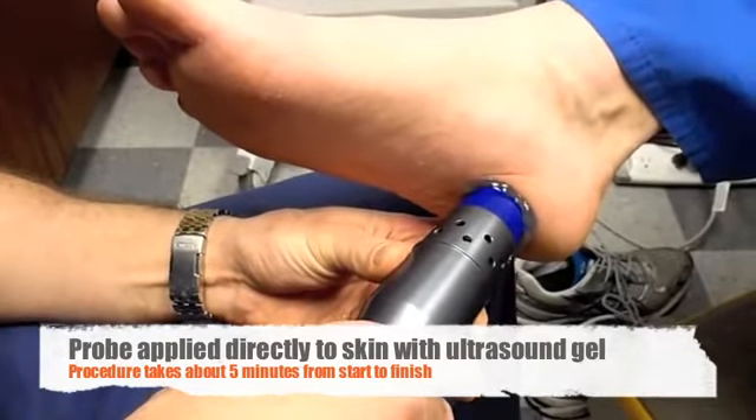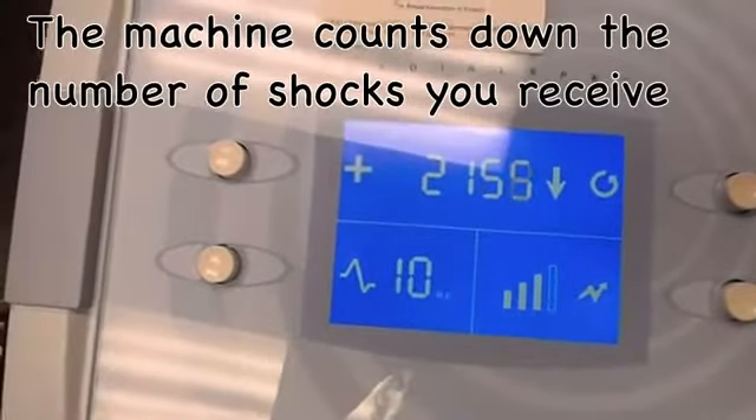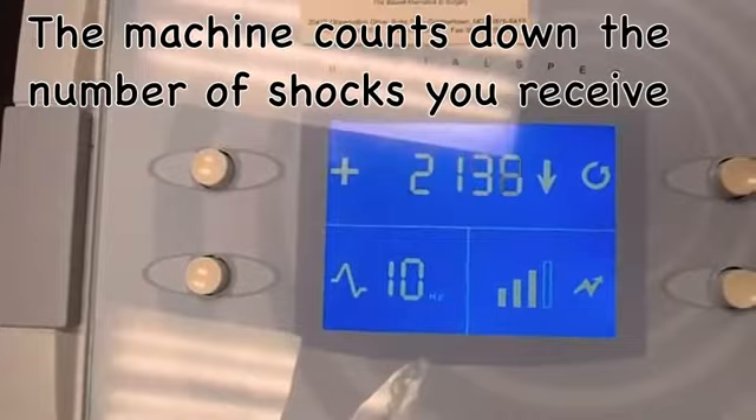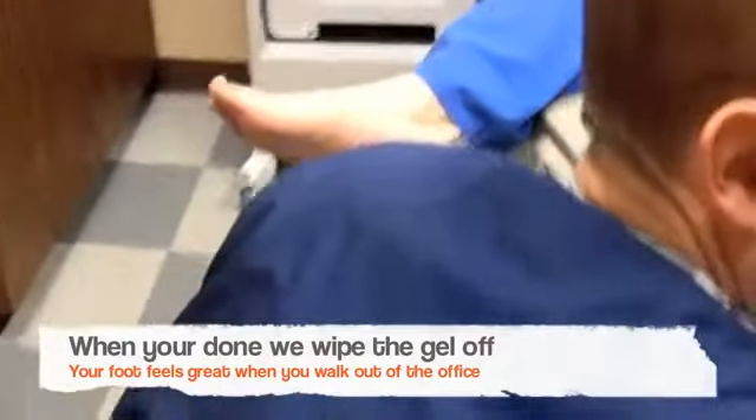We have great results with this. I've been seeing 75-80% relief. We use this little machine — it counts down the number of shocks, measures the strength of the procedure — and I've been amazed at the results that we've had.